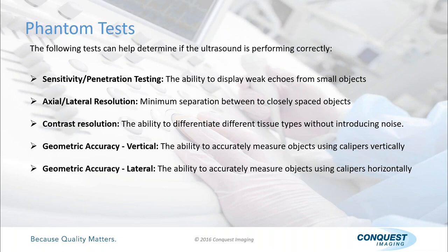But when we do that, we also want to make sure that we're using the proper tools. And I told you I had a class and my engineers weren't even using the same measurement technique. If you get close to this, there's a whole bunch of circles going down in rows, 5 different sizes. These are the objects you want to use to measure. I have a picture coming up.